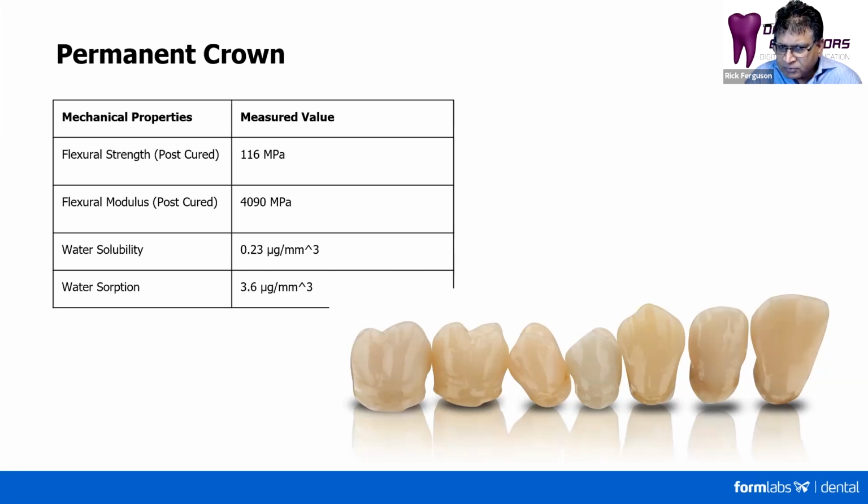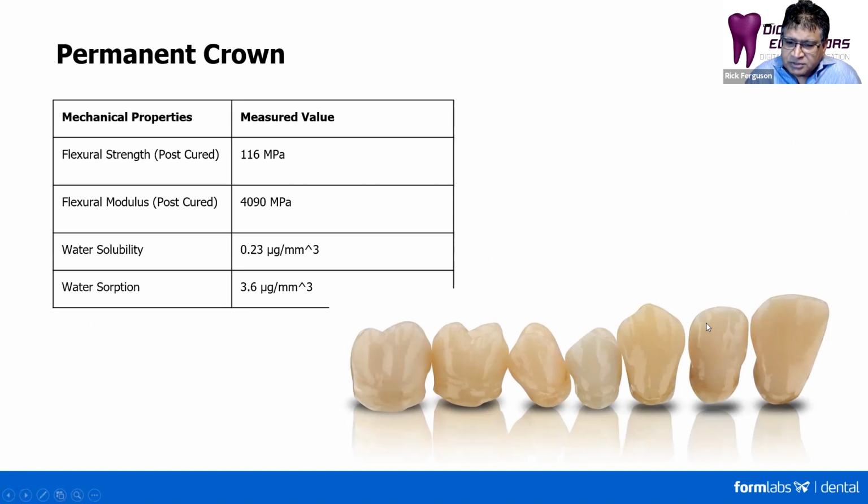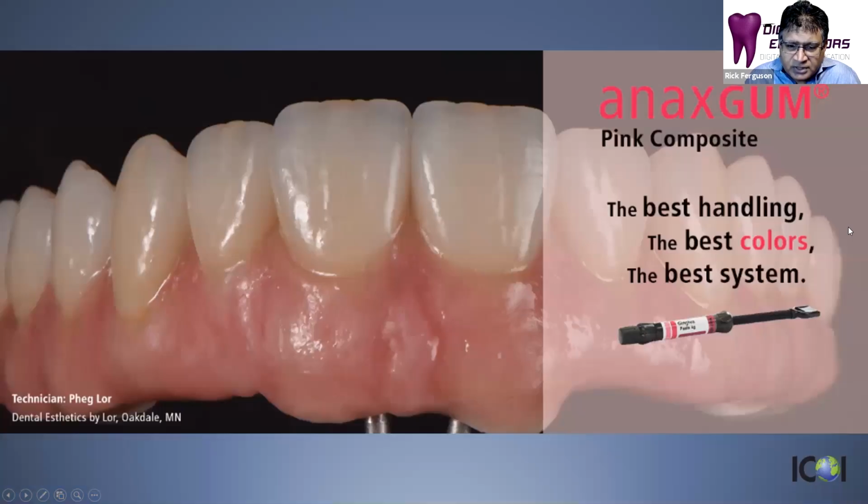What's nice about the Formlabs resins compared to the NextDent MFH in particular is that it is actually a harder material, so there's less wear. We don't have long-term studies, of course, but just cutting the material with a burr, I found that the Formlabs resins, which are actually made by a company out of Germany called Bego, this material I found to be much harder and a little bit more aesthetic than the NextDent MFH, which we have been using for several years now for temporary hybrids.